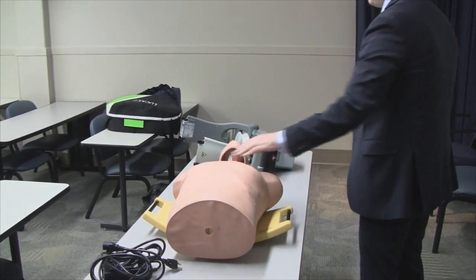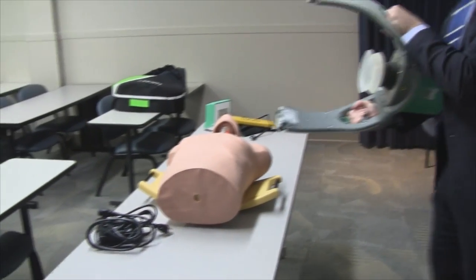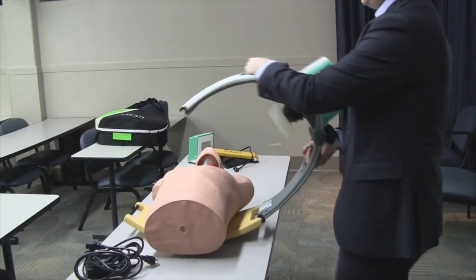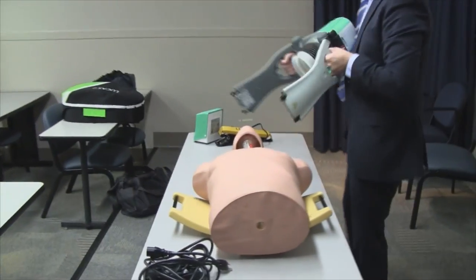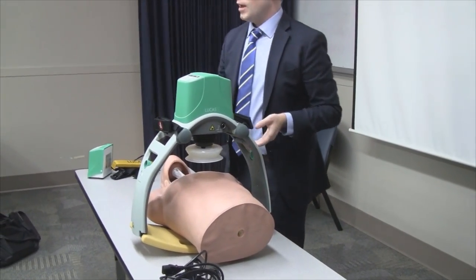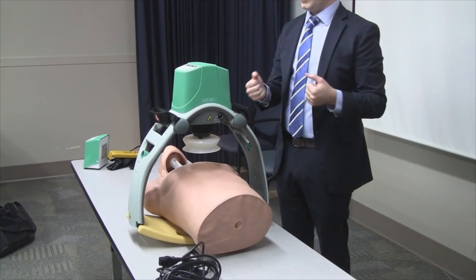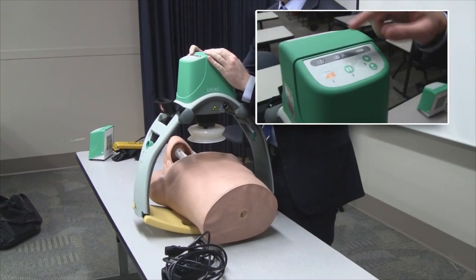Once the patient is set up, to attach the device you can do one of two ways: if somebody's doing compressions, you can hook up one side and then come over their hands and attach the other. Or on a surface where it's easier, you can come in from the top and connect both at the same time. I like to pull up on both arms just to make sure they're both connected so you don't have one that comes loose during operation.